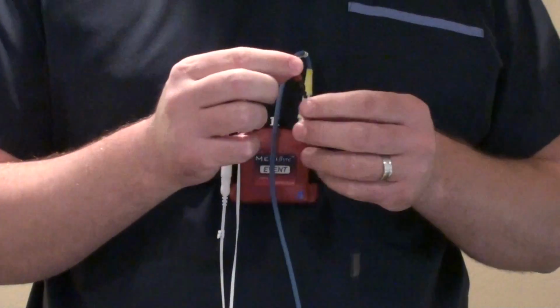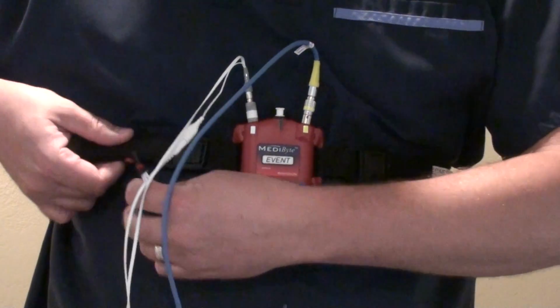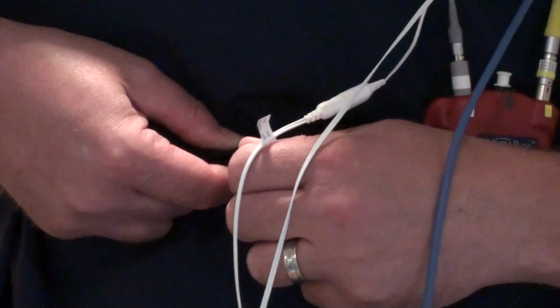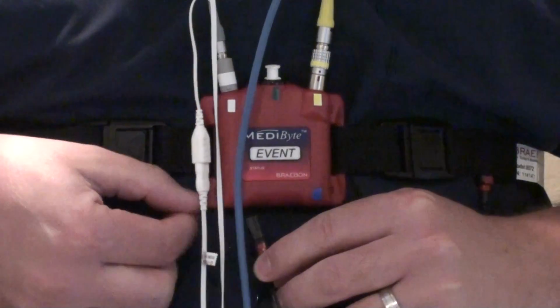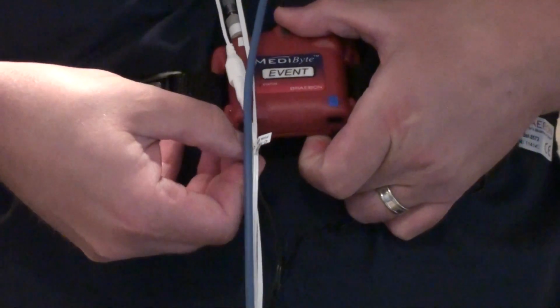Take the Y-shaped black cable marked with red tape and plug one safety pin connector into the right socket located on the belt. Plug the keyhole connector into the black keyhole input on the bottom right of the MediByte labeled chest, also marked with red tape.